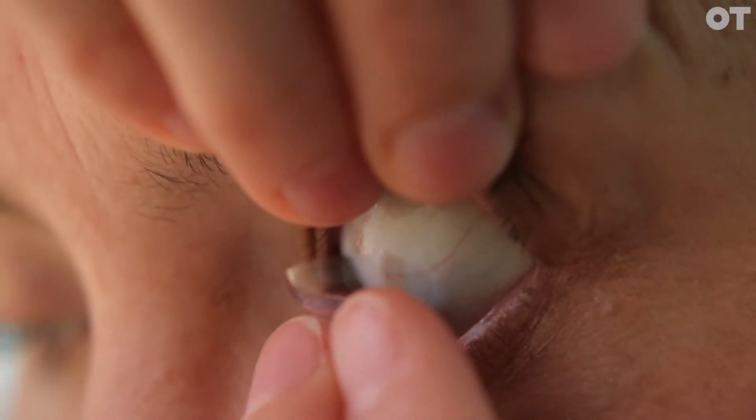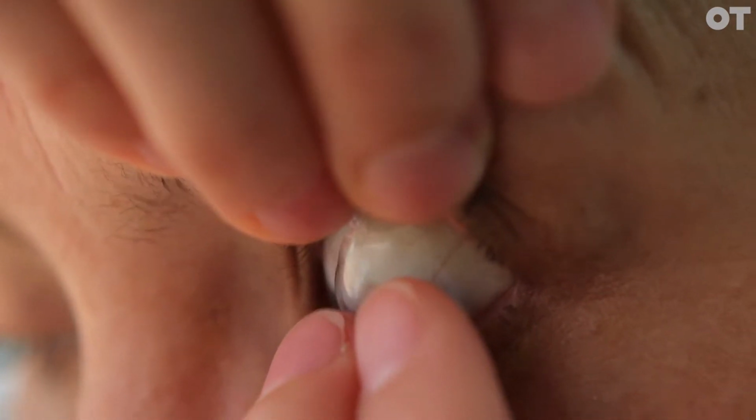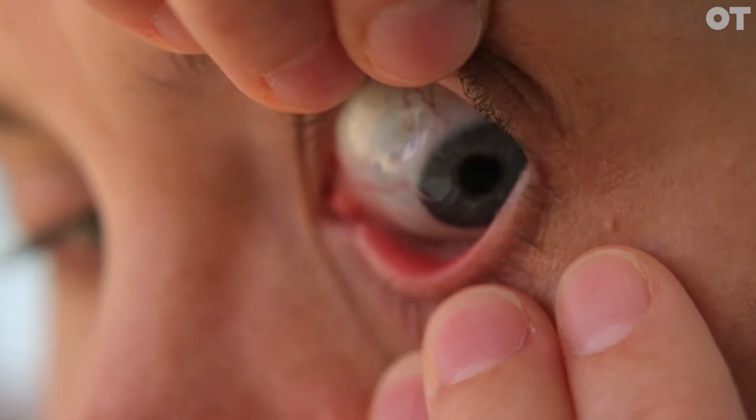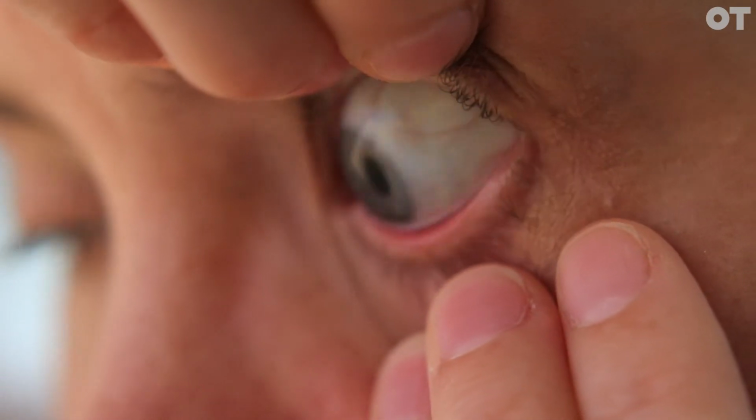So if they're really, really blinky, you'll probably find they can't put that lens right onto the middle of the eye. So it's a lot easier if they can look away at the last second. They might use a mirror to line everything up and get that lens just a centimetre from the eye and then look towards the nose, plonk it on the white bit, and their blink reflex won't be quite as strong. And the lens will centre itself anyway, so get them to not look at what they're doing. If they can look at what they're doing in the mirror rather than the lens coming towards them, sometimes that will lessen the blink reflex as well.